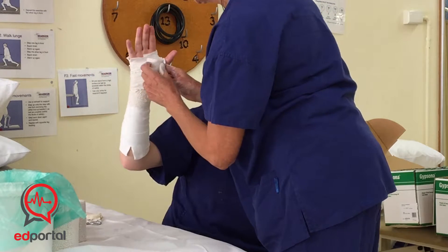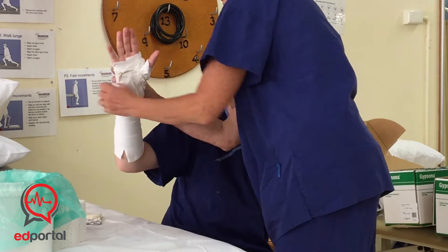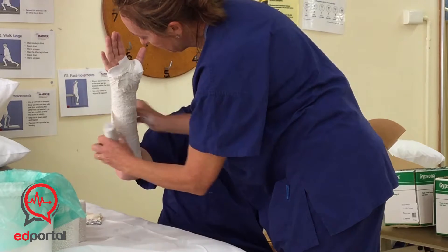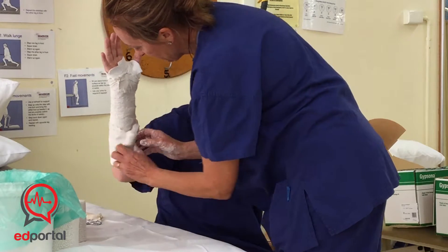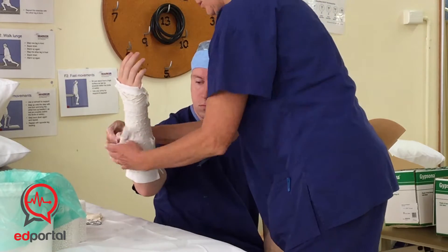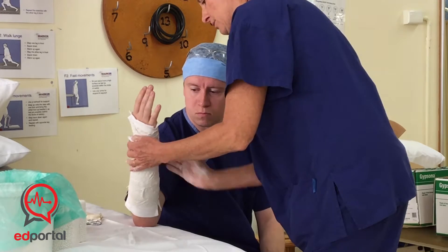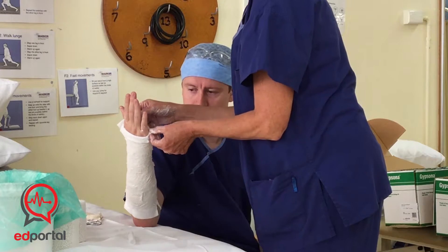Bring it up to where the cuts are, then drape it back down again. It's just a matter of overlapping 50-50, rolling it around — don't pull it on, just roll it on. A couple around the bottom and then wind the rest off going up. We want fairly even coverage over the cast. This is not your final layer, so don't work on it too much.